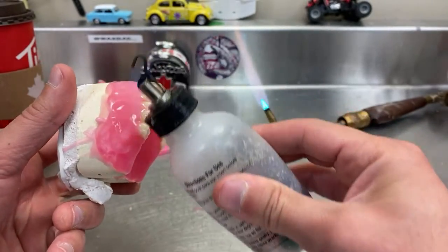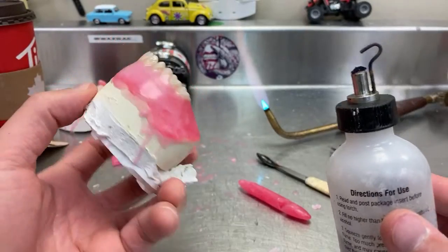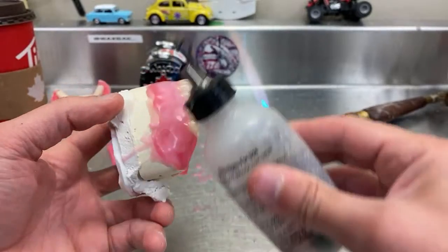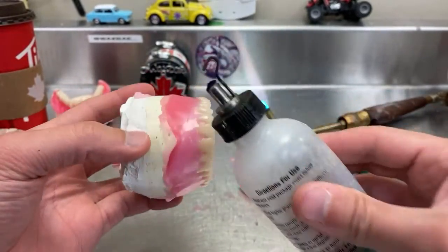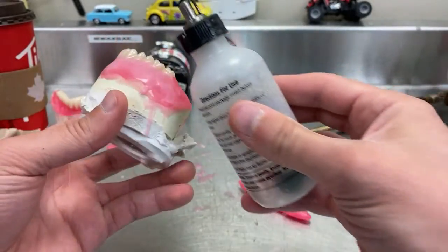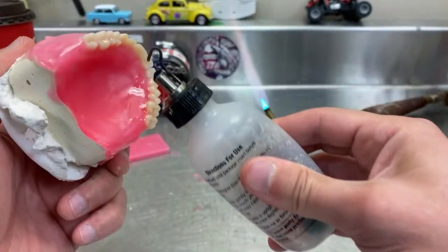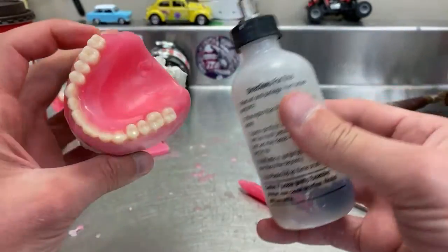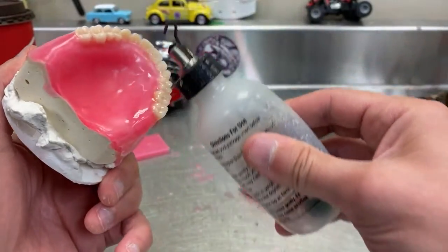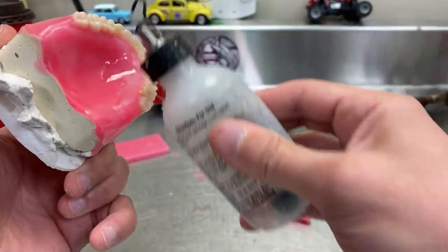And it's all in the angle that you hold. The whole art is in that hand, in the left, is how you're tilting in order to make the wax flow to where you want it to go. And once your wax is heated really good and nice, guarantee it will shine. You don't even need secret sauce.